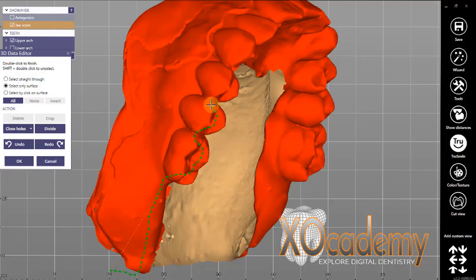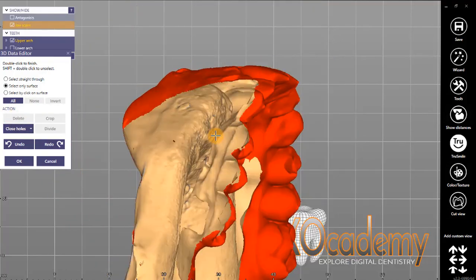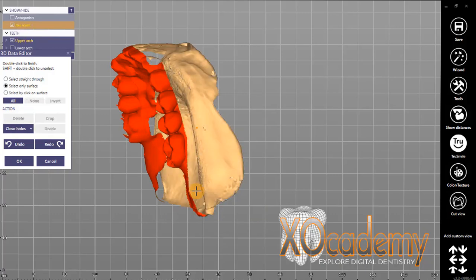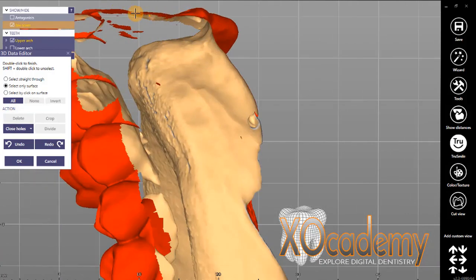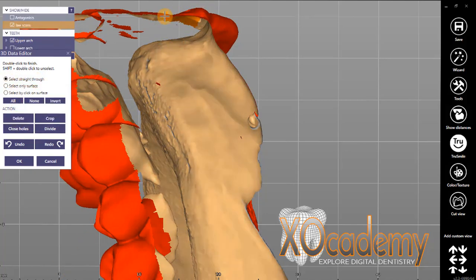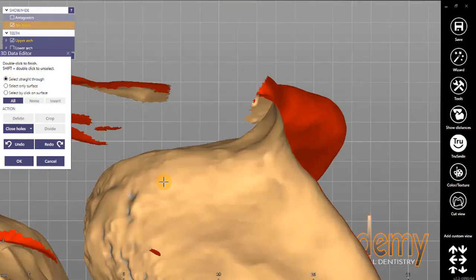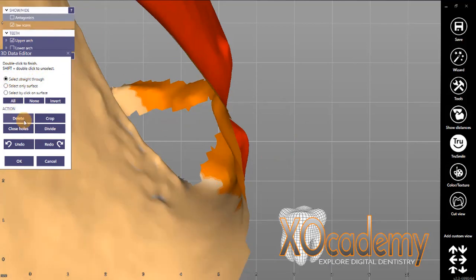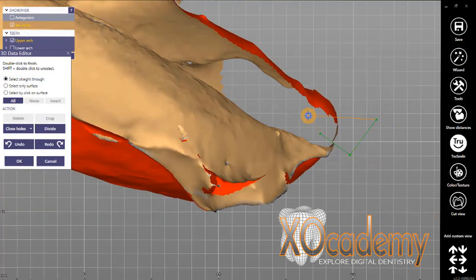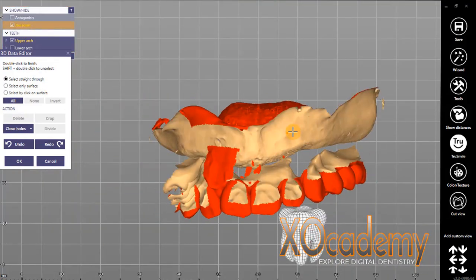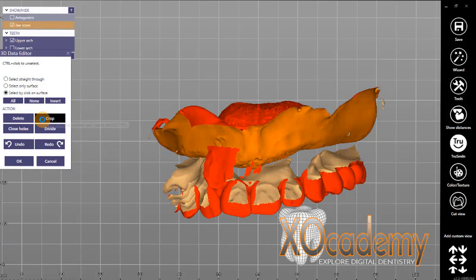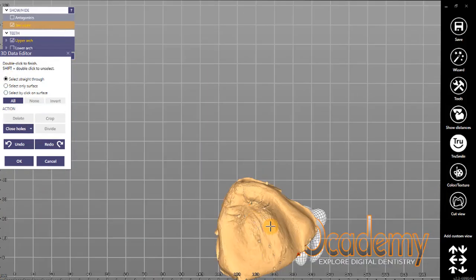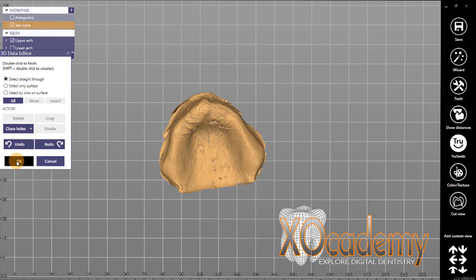Now we've got another problem — we need to get rid of just the teeth so that we can expose the palette and expose the edentulous area that our denture base will sit on. This is another area of ExoCAD, the 3D data editor, where you can edit STL files or scan files to remove any extra data, close any holes or gaps in the scan. In this part of the course I talk about how you can separate parts of a single scan so that you can erase everything you don't want all at once.